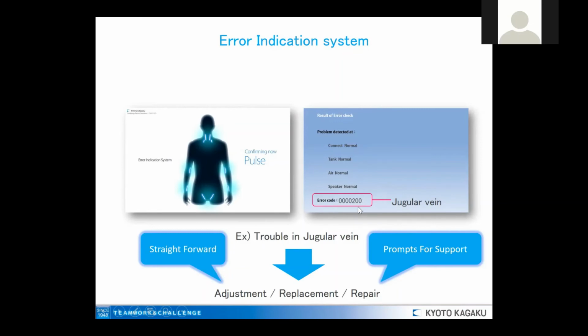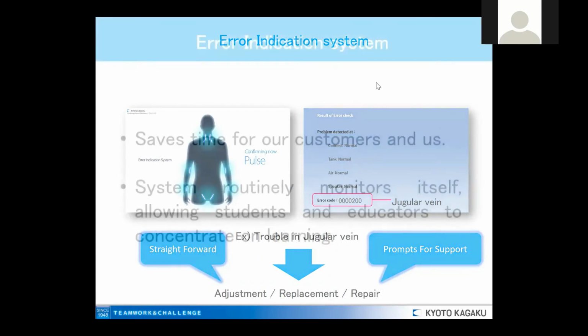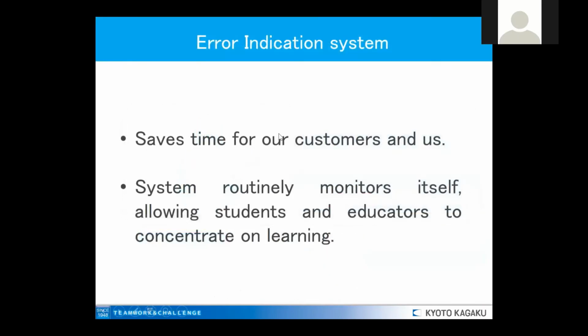Having it, you can just call us and give us this code, and we will have an idea about what the problem of the simulator is. We hope you don't need to use this, but in case, it's a very useful troubleshooting system. It also saves time for our customers and us, and it's very easy to use.